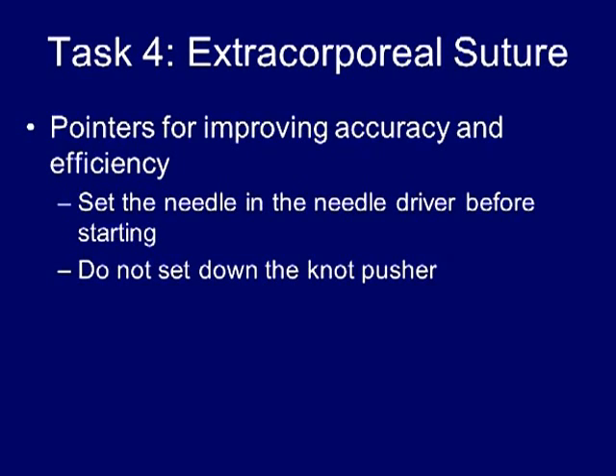For the extracorporeal suturing task, the right hand will introduce the suture into the box, and then the left hand will be used to reset the needle into the right hand to allow for driving of the needle through the Penrose drain. The right hand will then withdraw the suture back through the right-handed port. Therefore, orient the needle in the right hand in the proper orientation before delivering it into the box to start the exercise.